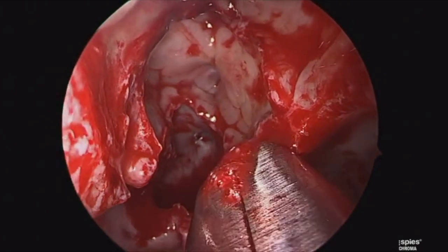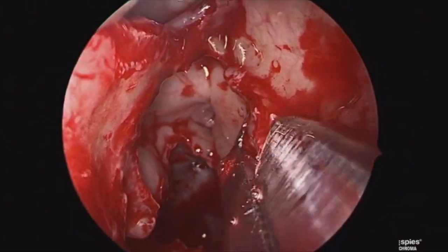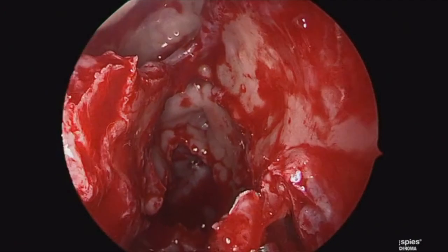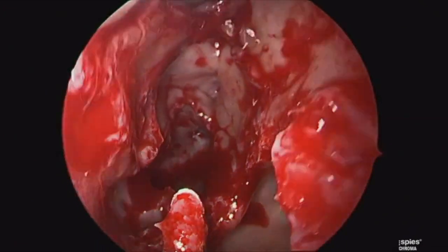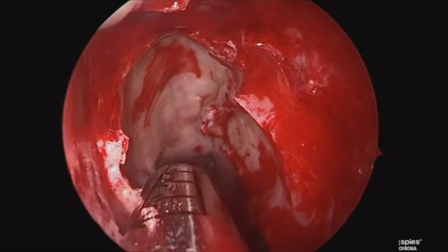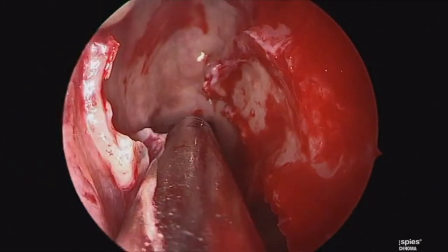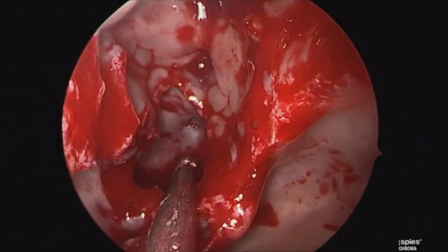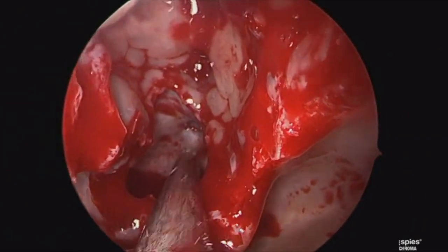Here we are taking down the last bit of the maxillary sinus to truly open that retromaxillary space in order to have that lamina papyracea truly skeletonized. Again, cleaning up the last bit of the ethmoid partitions here with the microdebrider in order to have everything nice and widely open and fully skeletonized.